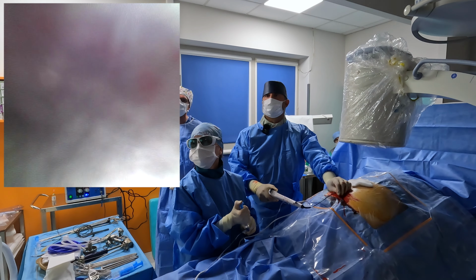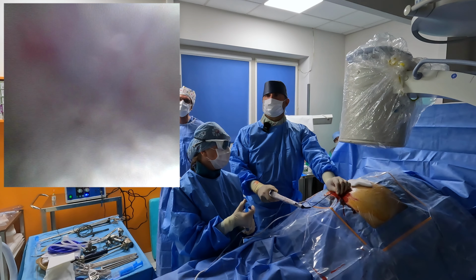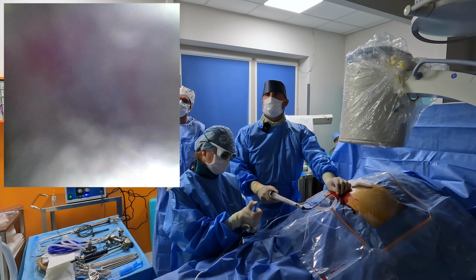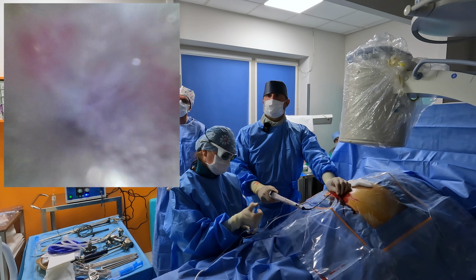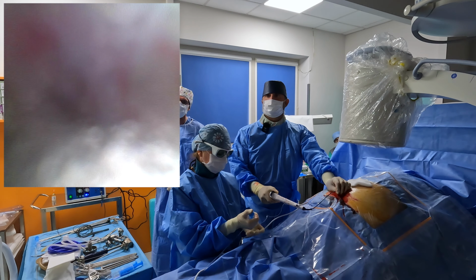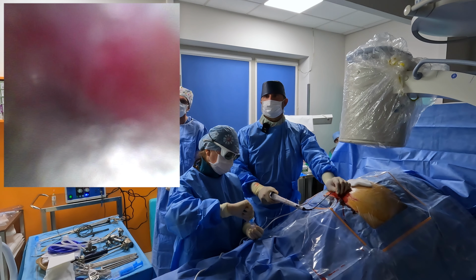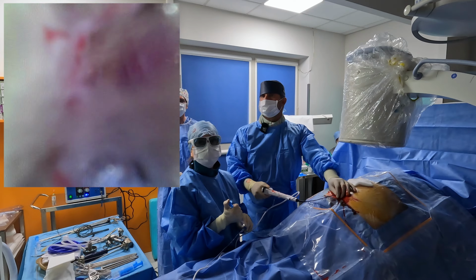And you see here, there is clearly some kind of inflamed dura. So for some reason, this red color on the dural sac with adhesions is showing us some kind of evidence that something at this level is wrong. And that's why it's maybe wise to give some kind of treatment for this level.